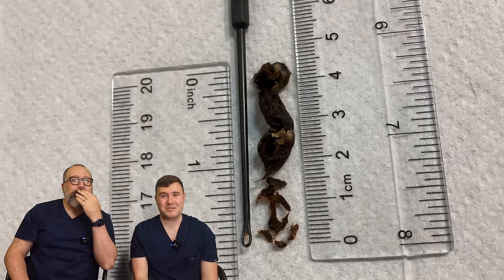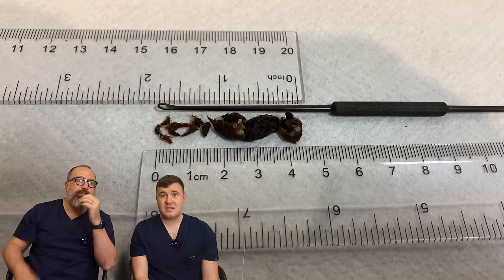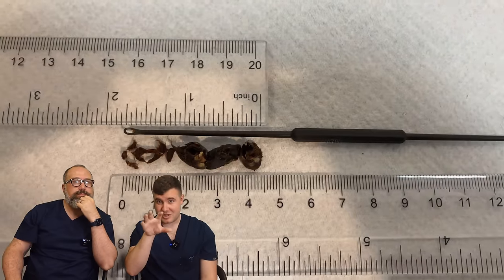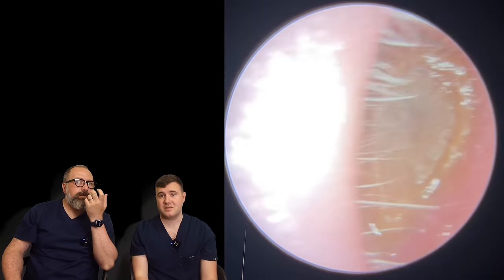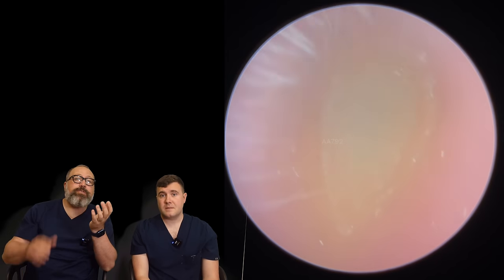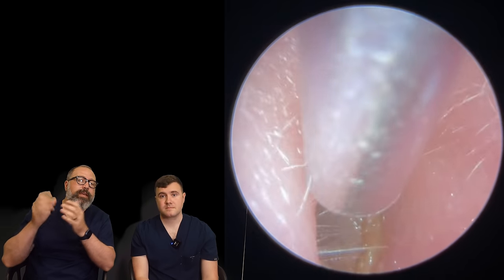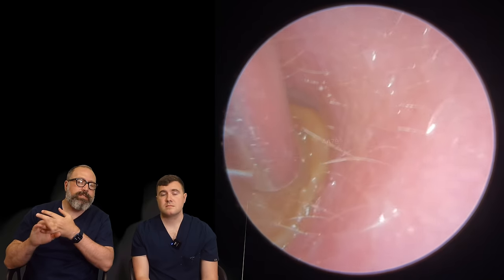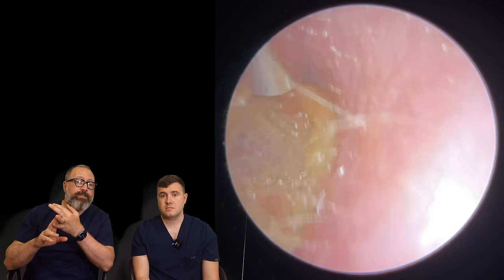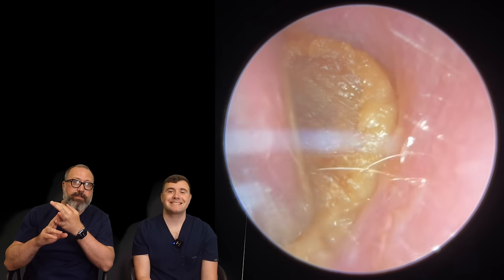Look at the size of those plugs. You've had some really big plugs recently. Four and a half centimetres, by the way. I've actually added the Jobson hone here so you can see the size difference of the plugs. Somebody did ask in the comment section if we could put a couple of the tools on as well. Guys, don't forget — if you're having problems with your ears, you can always come and see us here. Check out the link in our bio. It's got our website and our contact details on there, so no matter what platform you're watching this on, there will be a link to our website. Get yourself booked in with myself or Taylor Green and we'll get this sorted out for you.